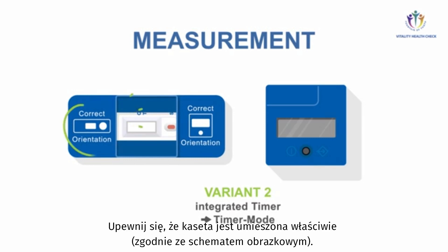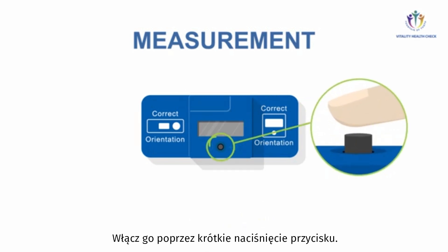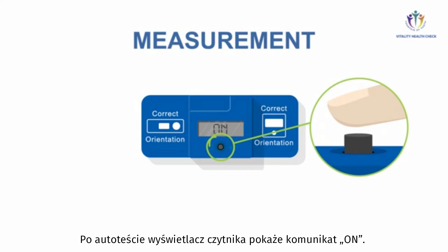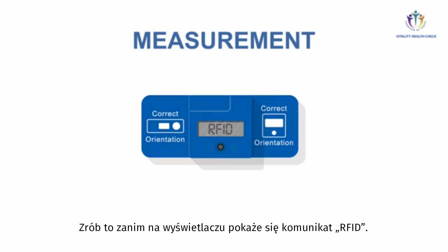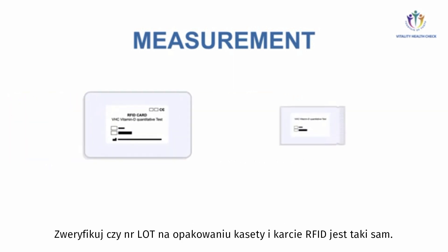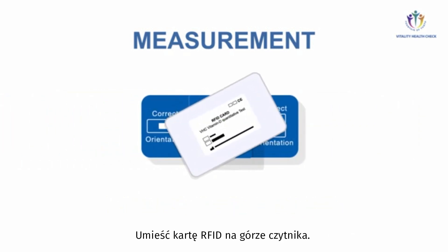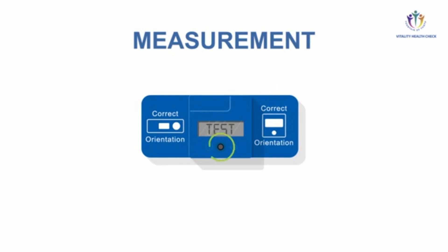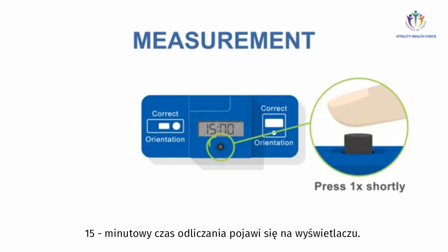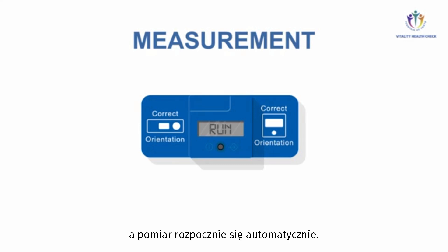Check for correct alignment according to the pictograms. Place the VHC Reader in the right direction on top of the adapter. Turn it on by pressing the button shortly. After a self-test, the VHC Reader shows 'on.' Timer mode can be activated by pressing the button long until the display switches and shows RFID. Verify the lot numbers of the test packaging and the RFID card are the same. Place the RFID card on top of the VHC Reader — a beep tone confirms data transfer is completed. The display will show 'test.' Press the button again, and the 15-minute countdown is shown on the display. At the end of the countdown, the display shows 'run' and the measurement is performed automatically.